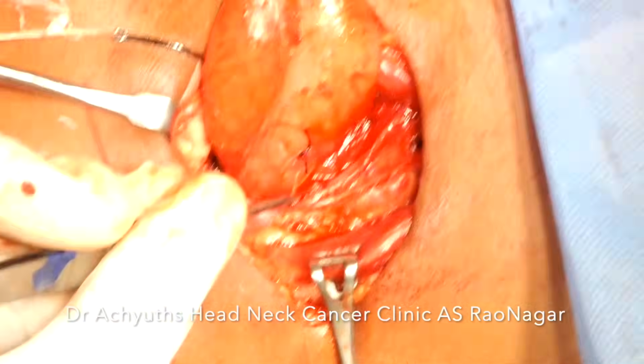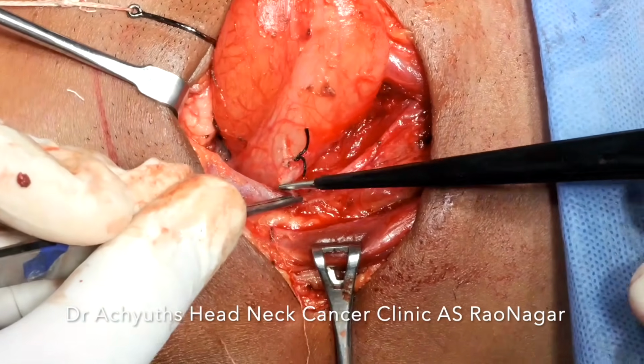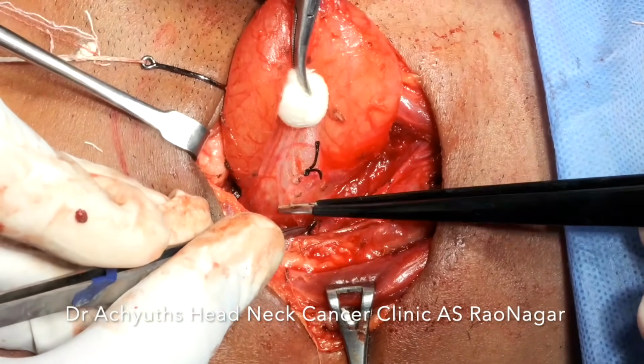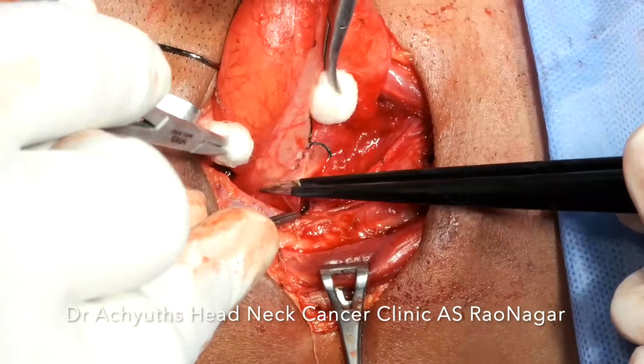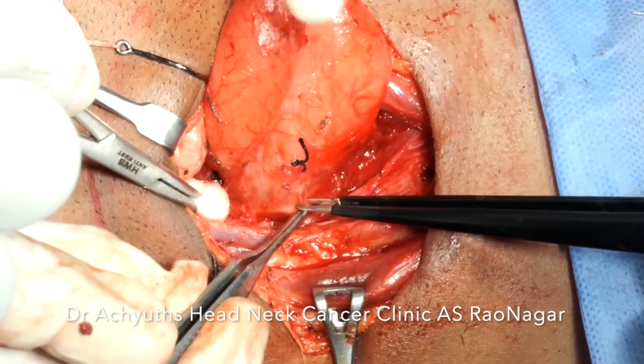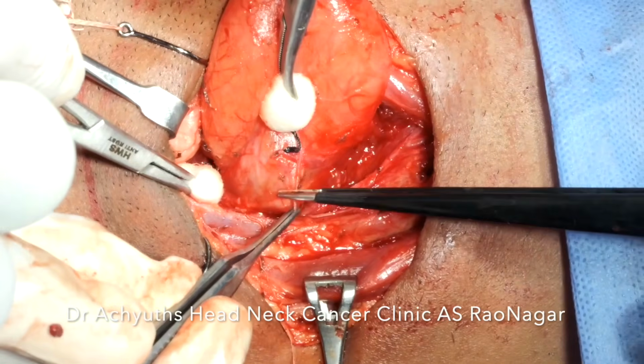Gradually you can identify that the cyst is delivered more into the neck. It is becoming more and more mobile as you divide the fascial attachments. Now you are more confident and convenient in dissecting.